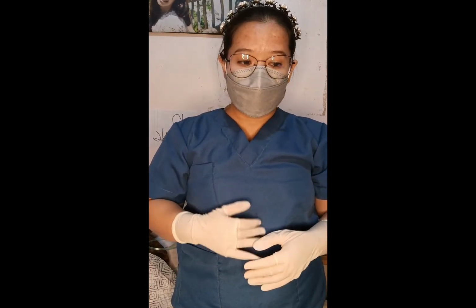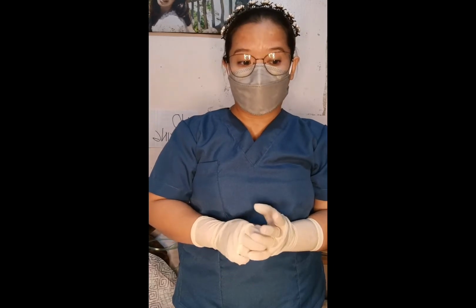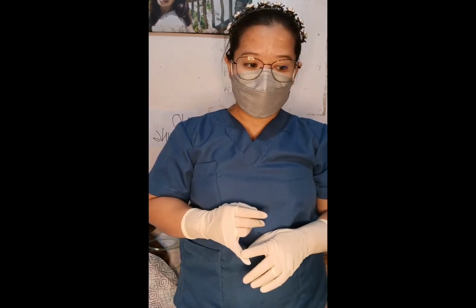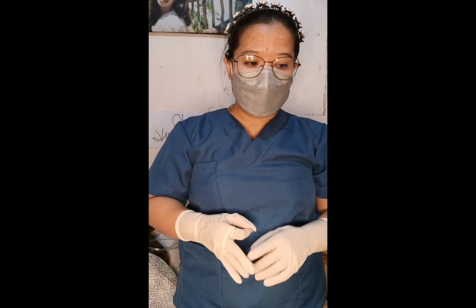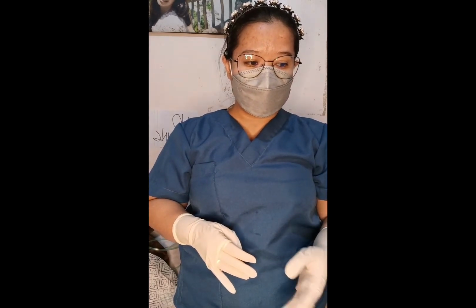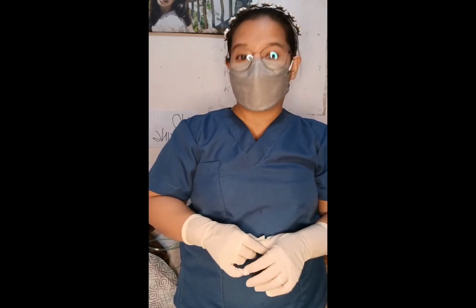We also need to assess the proper functioning of the equipment and observe the client's initial response to the therapy. By doing that, we need to assess the vital signs, the oxygen saturation, the color, the breathing pattern, and the orientation, which help us as caregivers and nurses evaluate the effectiveness of the therapy and detect clinical evidence of hypoxia.